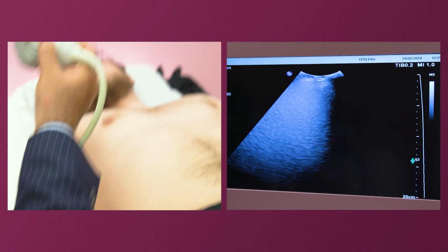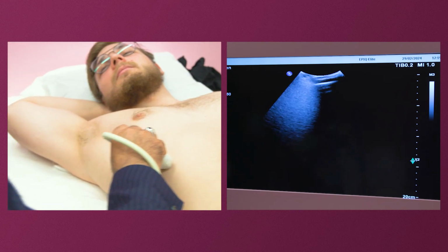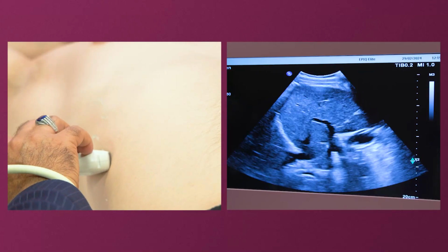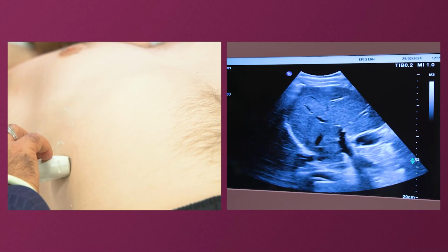The amount of fat in the liver doesn't affect the fibrosis scan. It's independent. The measurements are independent. Yeah. So it's only the hepatitis that you need to know about. I'm not the NMR expert, so I can't tell you what they do. Yeah, I think they use it to a very standard protocol.